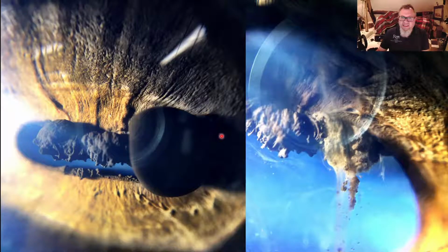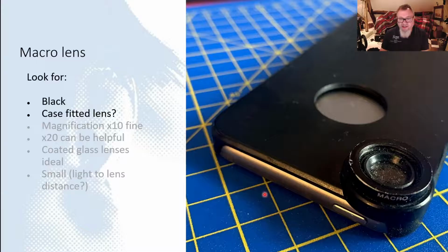This is just a reminder as to why we want a black lens. This is a horse with an iris cyst. Dogs and cats have them as well. This is before surgery, and this is after surgery. We use a laser to ablate them, and you can see individual melanocytes floating away into the vitreous. But this big white annoying ring is because we have a silver macro lens, which you can still see the pathology through, but with a black macro lens you get less reflection.